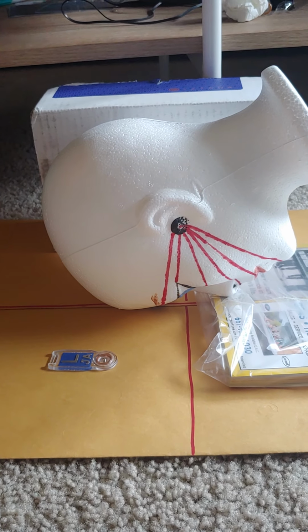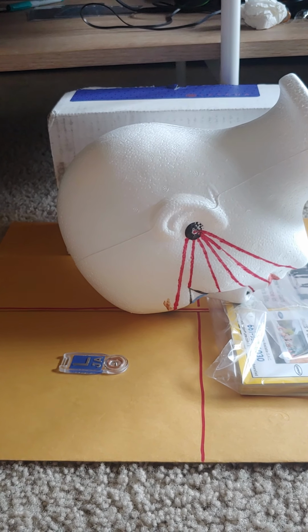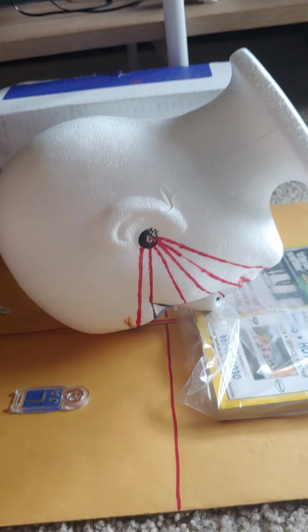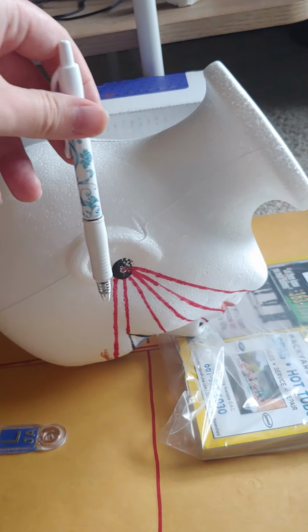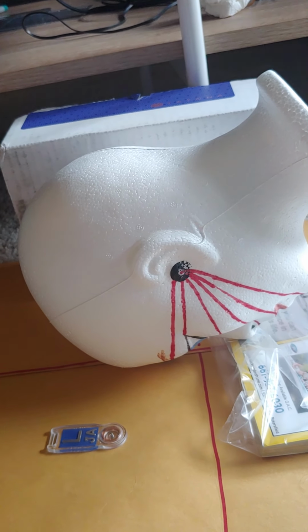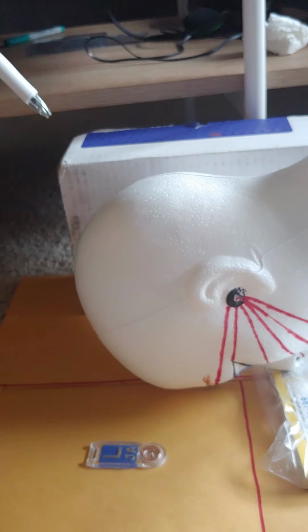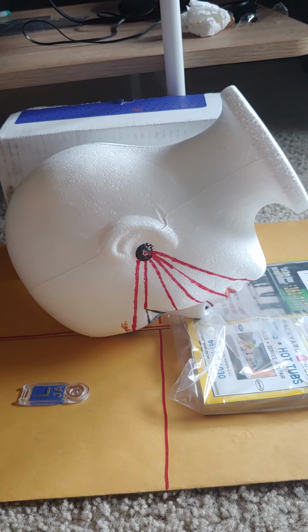This is my PA Caldwell skull projection. In this projection, the MSP is perpendicular to the IR, and the OML is perpendicular. So that's the OML right there. There is a 15-degree caudal angle, so it would go in about right there. The exit point for this projection is at the nasion.